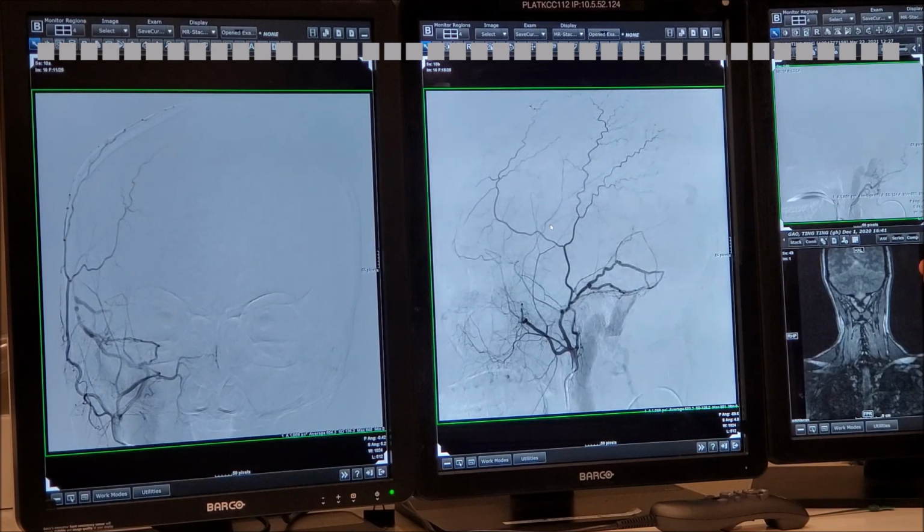Here you have venous drainage down to the sinus, right? There's no evidence of thrombosis. There is no evidence of reflux to the intracranial drainage, right? So this is called type 1. I hate all this type 1, type 2, 2B, 3A. The bottom line is there's no thrombosis. There's no venous reflux.